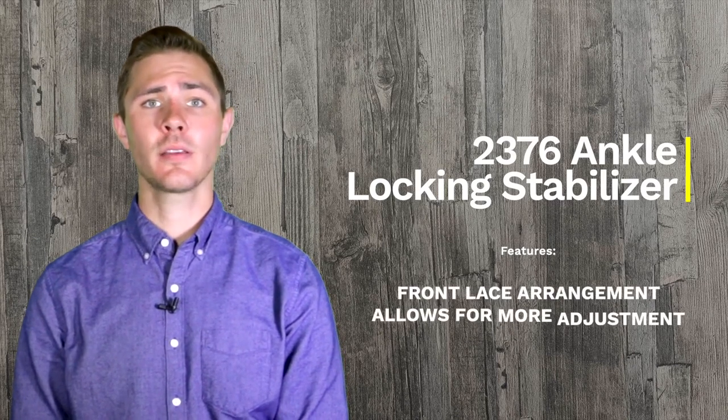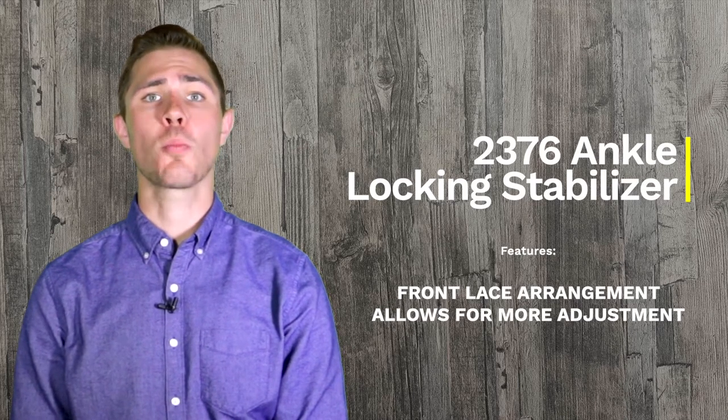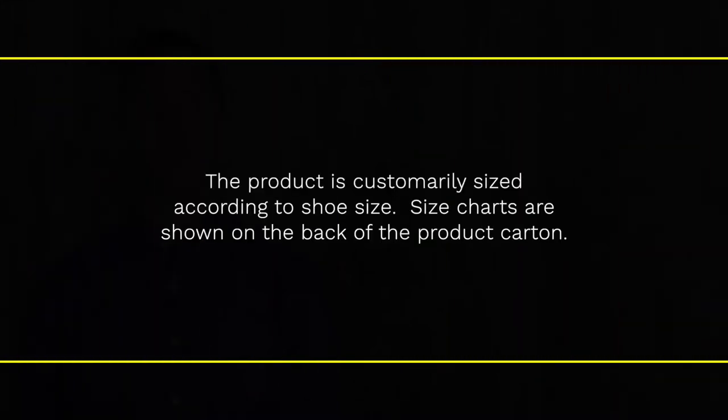The front lace arrangement allows for more precise adjustment than is permitted with a wrap-around or pull-on style of ankle support. The product is customarily sized according to shoe size, and size charts are shown on the back panel of the product cart.